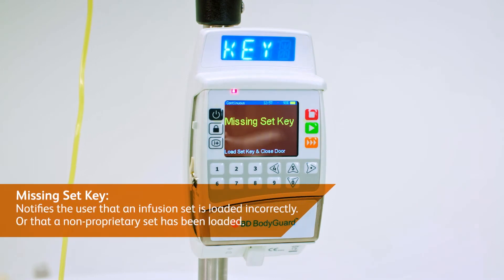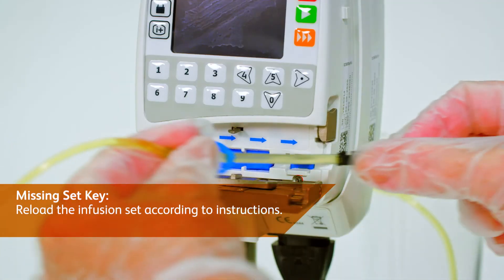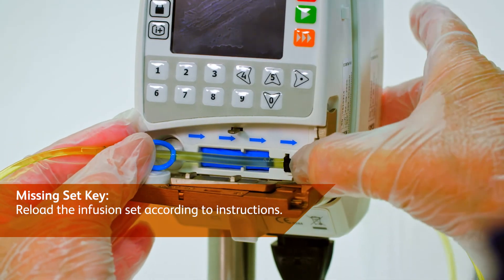Missing set key notifies the user that an infusion set is loaded incorrectly or that a non-proprietary set has been loaded. To resolve this alarm, reload the infusion set according to instructions.